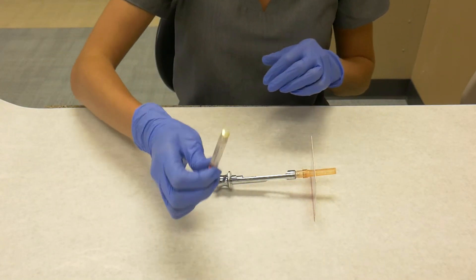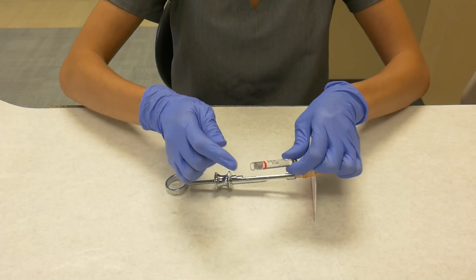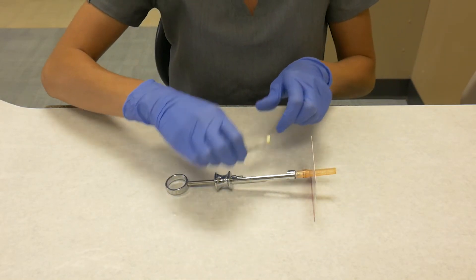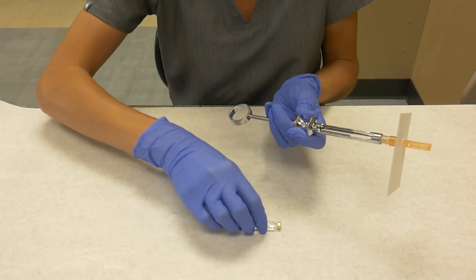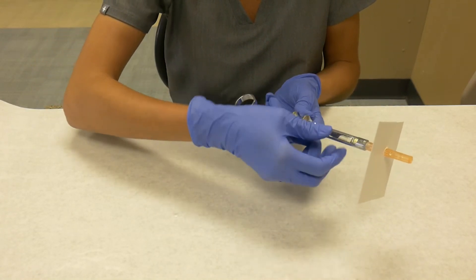Now it's time to lock and load. Grab your cartridge and note the rubber stopper on the end. Pull back on the thumb holder of the syringe and place the cartridge into the barrel.